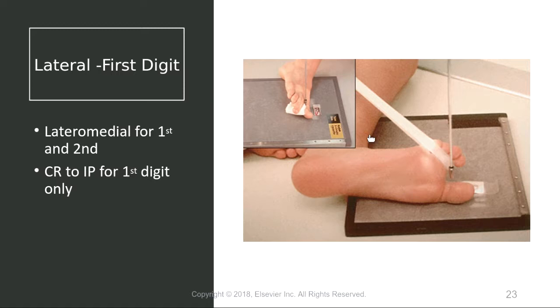And you always want to tell the patient why you're doing that, which would be to isolate the first digit, to help the patient hold still, to move anatomy out of the way. Whatever the case is, just communicate with your patient, and they're very willing to help typically.